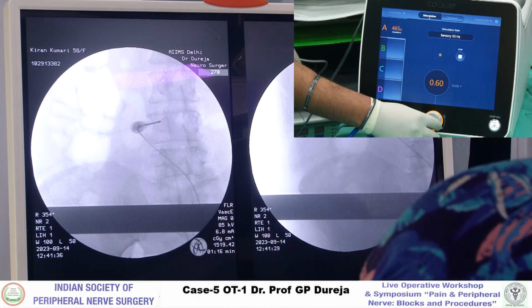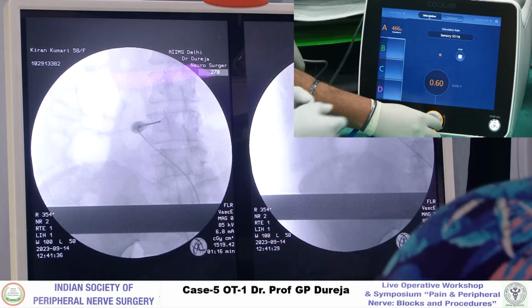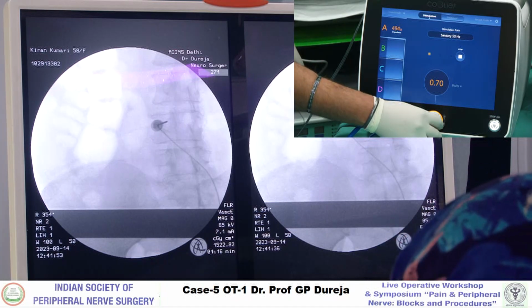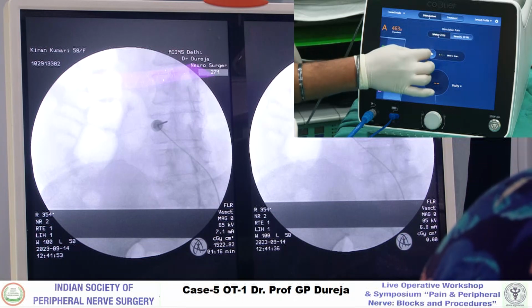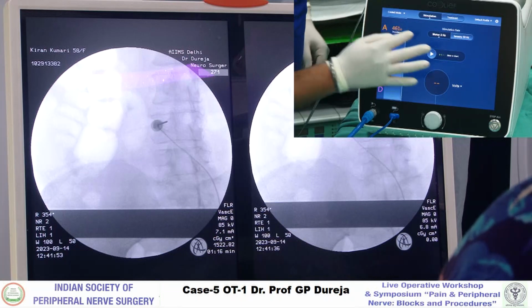हैवी लग रहा है, बट लोकली. टांग में तो नहीं जा रहा? नहीं जा रहा. We can increase it a little bit and see. थोड़ा सा और दीजिए. बढ़ गया जी थोड़ा? ठीक है. मोटर. So now there will be muscle fasciculation of the erector spinae group.